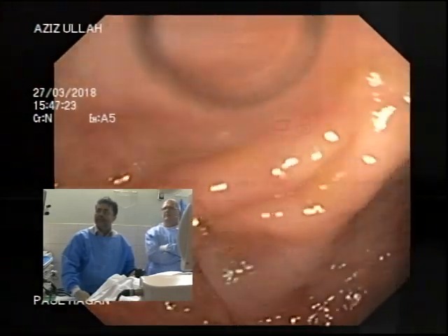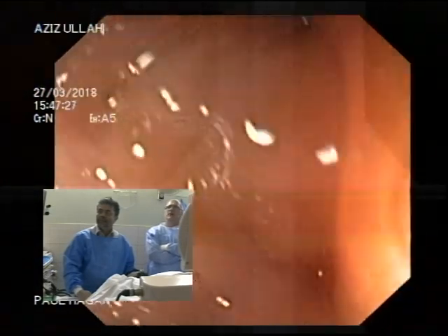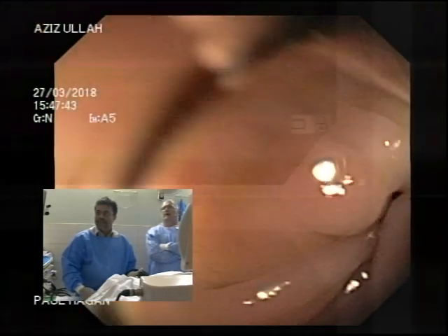Advance. Advance. Tip up. You've got to keep that lumen central. You've seen the folds where they're actually going. Blow water, minimal clockwise torque. Advance. Advance. Minimal clockwise torque.